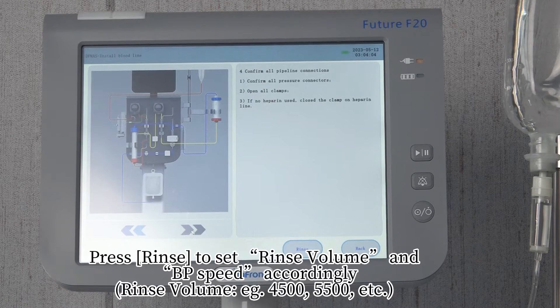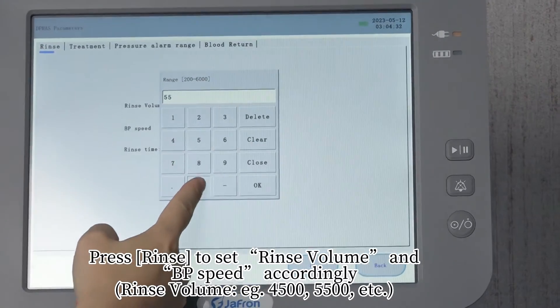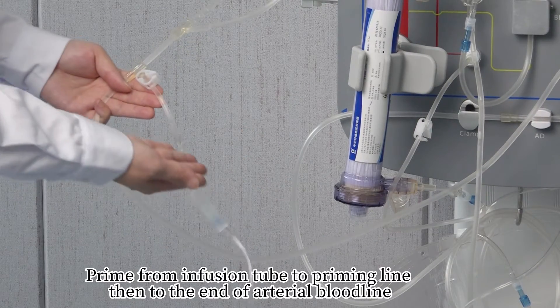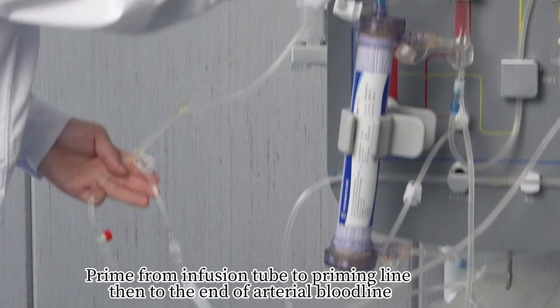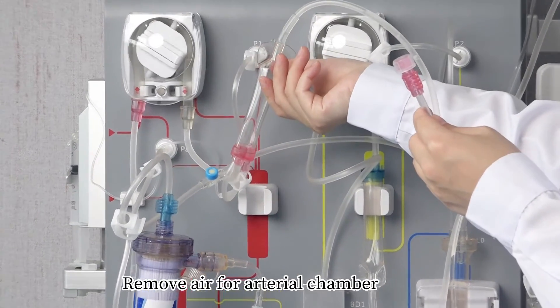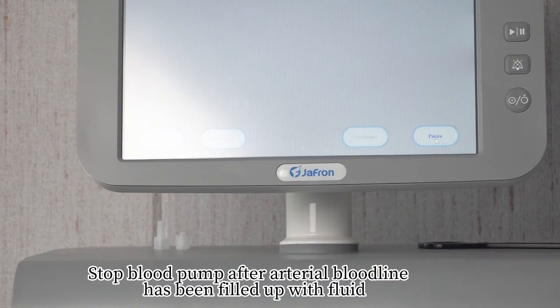Press 'Rinse' to set the rinse volume and blood pump speed accordingly. Start automatic priming. Prime from the infusion tube to the priming line, then to the end of the arterial bloodline. Remove air from the arterial chamber. Stop the blood pump after the arterial bloodline has been filled with fluid.